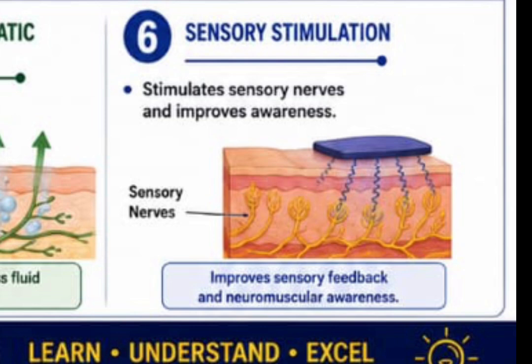It stimulates all the nerves across that area and makes them active. That is why if you overstimulate, the pain receptors will be sensitized, and the signal will be sent to the brain. The patient will also feel it, which means you are also stimulating touch receptors. So there are so many receptors that are stimulated when you are using a Faradic current.